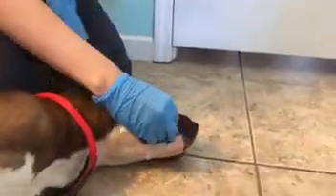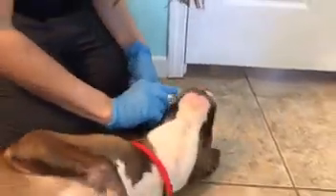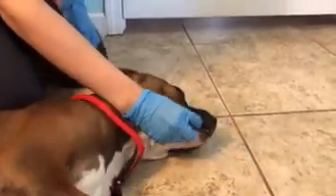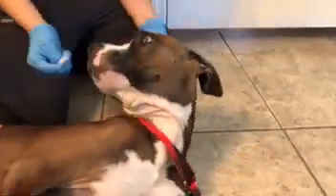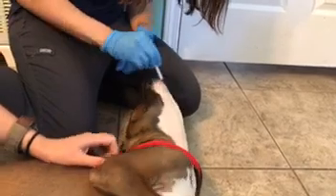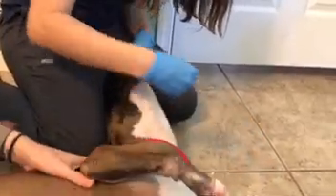I'm good with that. And you can count to yourself as well. It doesn't have to be exactly 60, but use those handy dandy pocket timers. Yes, exactly. And I like to tickle under the throat as well. You can make this into a game as well. This is a great dog. Does the saliva go into the hole, or is it just saturating the whole thing? It's saturating the whole thing. Yes.